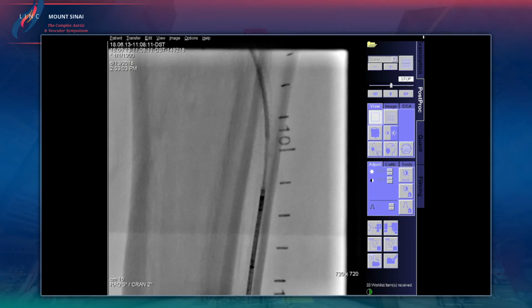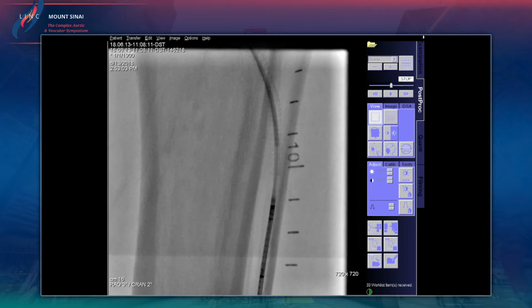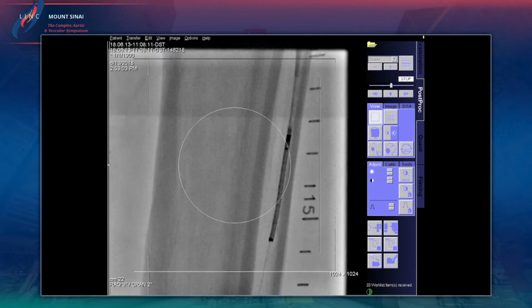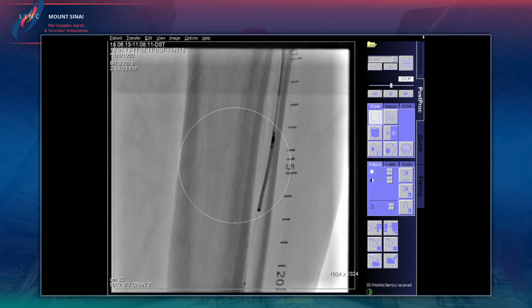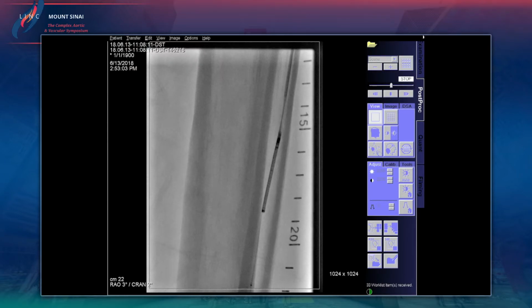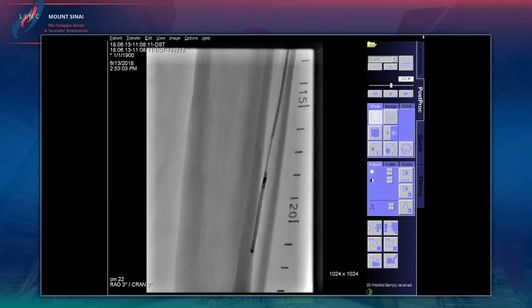What kind of atherectomy? Maybe I didn't hear that. Turbo. This is the TurboHawk. Go ahead, turn it on. So we're just going to make two passes here very, very slowly. It was from what to what? It was like 12 to 18? Or 12 to 20 is what I was thinking. 20. Okay. And then come back. This is the tightest spot pretty much. And then come back and take a look. Slow, cowboy.